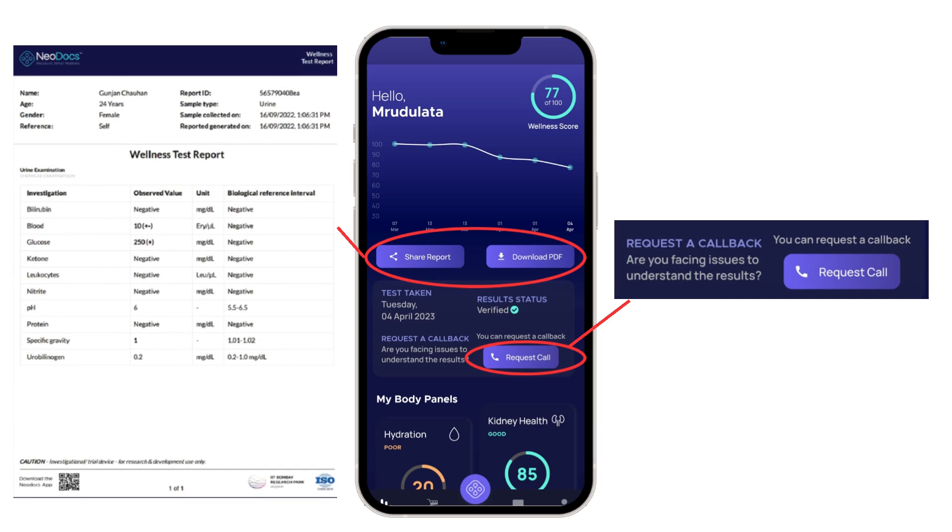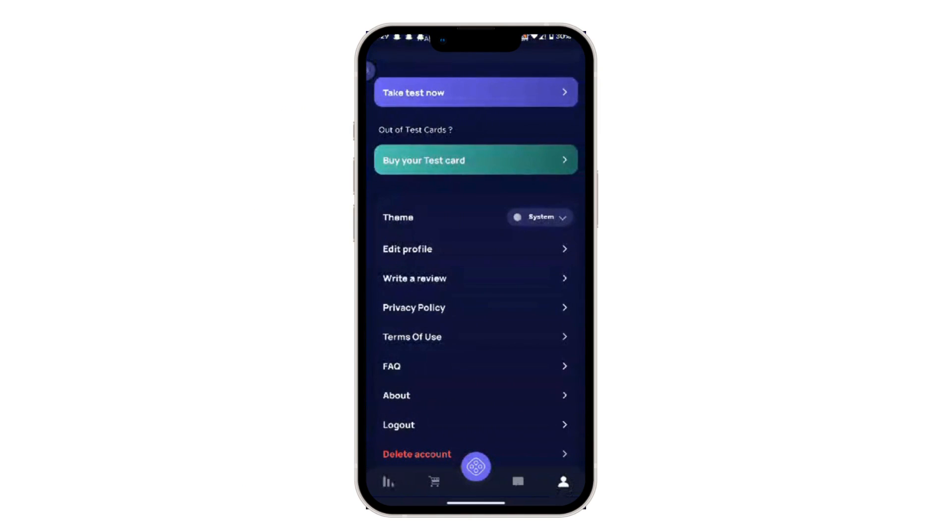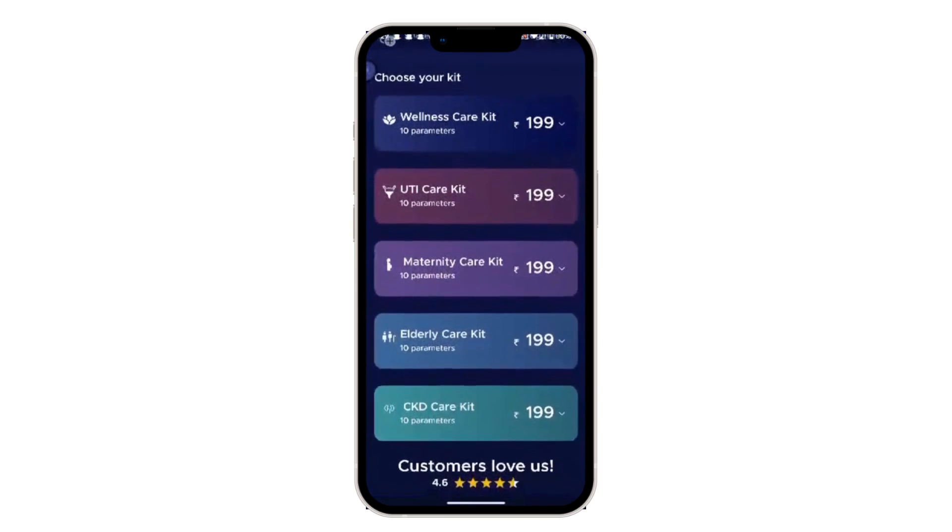You can download and share the PDF report from the app itself by clicking on the respective buttons on the homepage. To buy more kits, tap on the profile button and click on the relevant links.